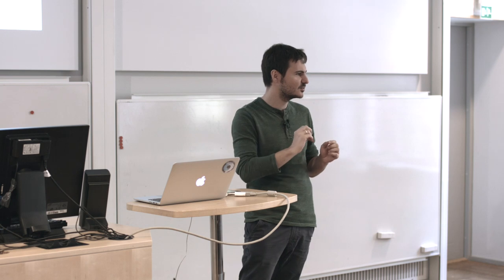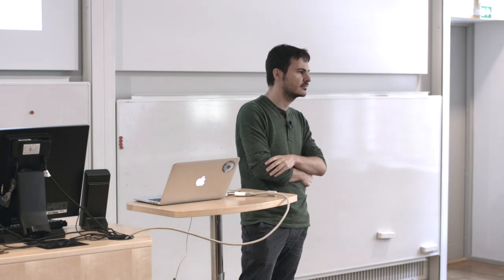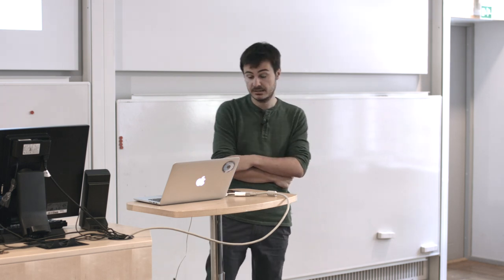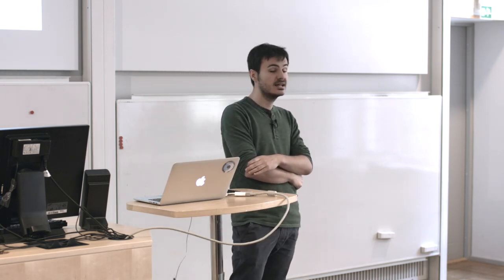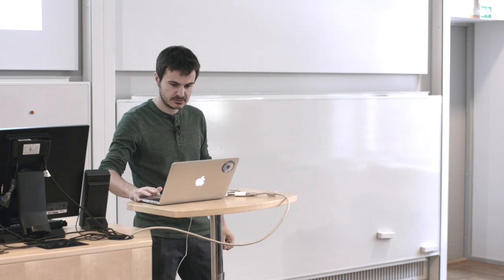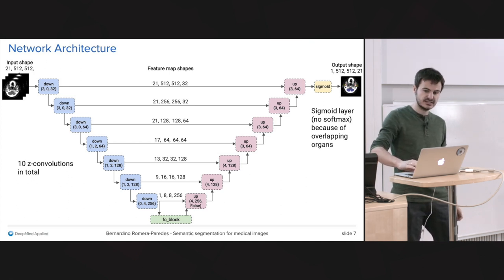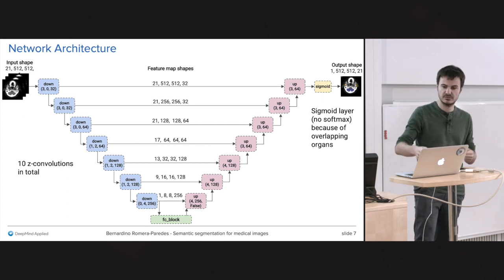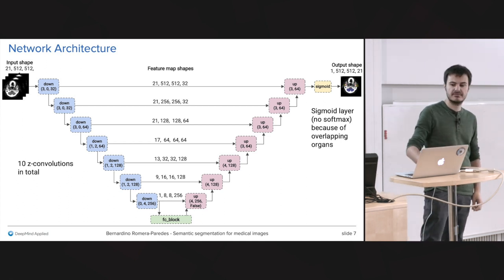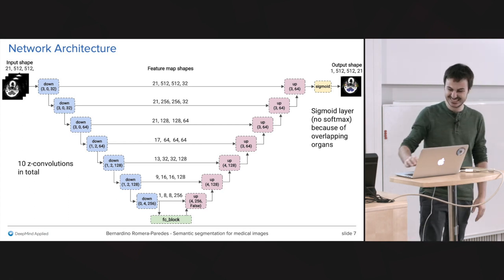Do you have any specific way in mind? Well, I'm envisioning you have your generated images, which have the analysis, and then you have examples from the radiologists. You could have a discriminator network that could help train your network. Maybe you didn't have enough training data to do that. It could be an option. The thing is, I think what you are saying is that we have as an input CT scans, and as an output the segmentations. Right now we are using a pre-specified loss function, in this case the sigmoid cross entropy. But yes, we could also have a discriminator instead of a loss function so that you learn the loss. But we keep it simple. But yeah, that could be an option.